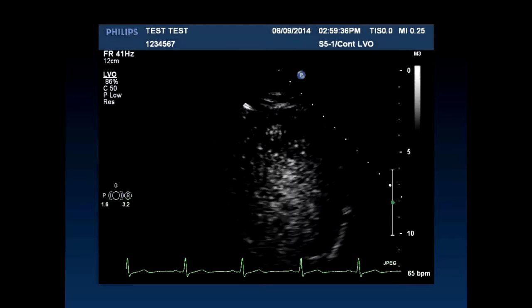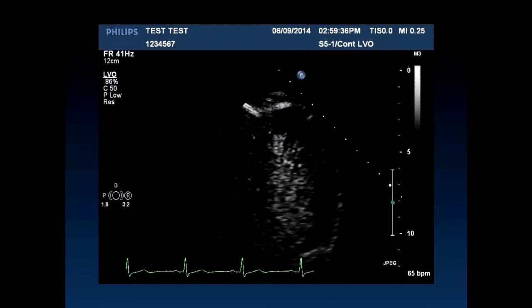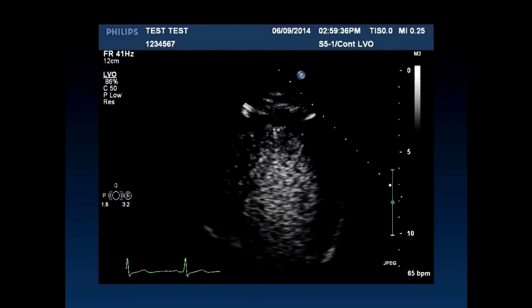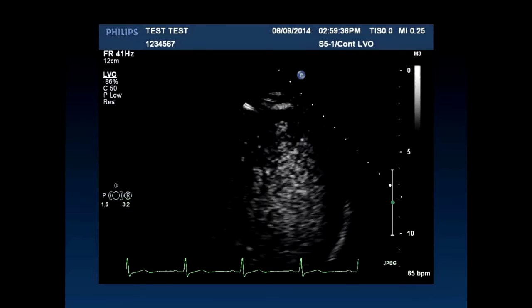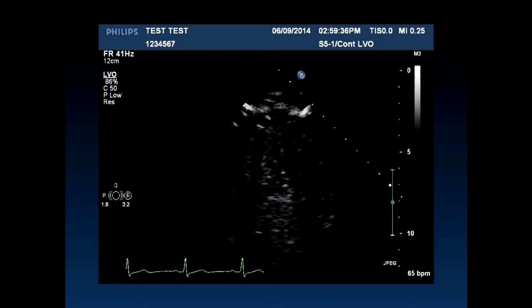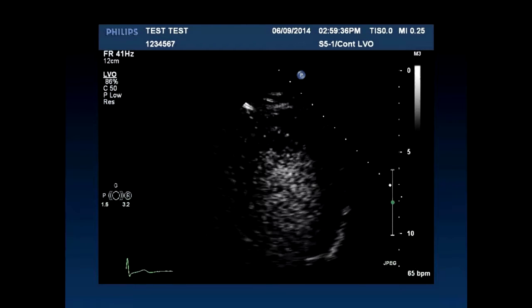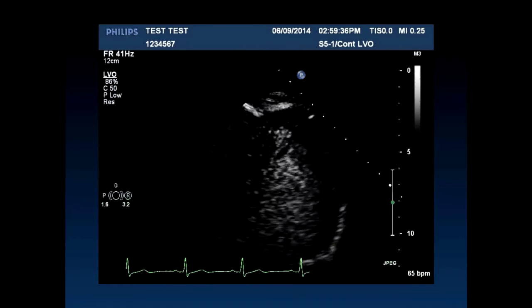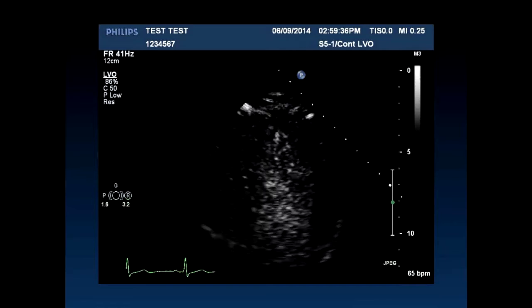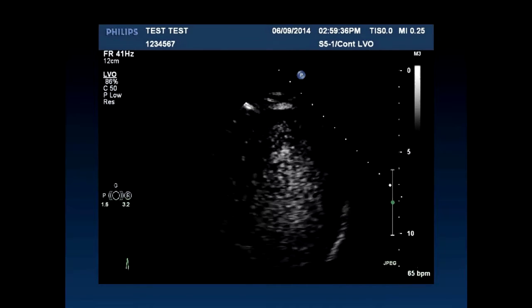In this image, the mechanical index, as you can see in the top corner, is appropriately low, but there is still inadequate contrast in the left ventricular cavity because the microbubble concentration is too low. Either another slow bolus is required or the infusion rate needs to be increased. If you are out of bubbles in the syringe, you could try simply lifting the patient's IV arm and massaging the vein a little bit to encourage the entry of some bubbles that are left residual in the patient's vein.